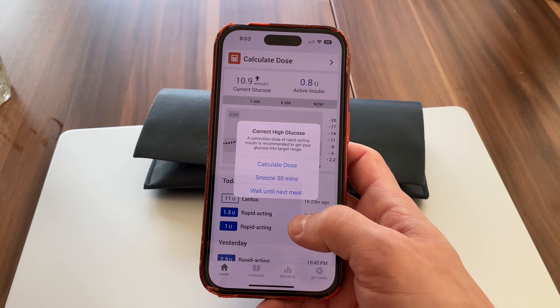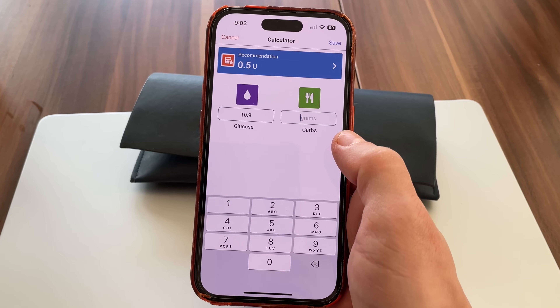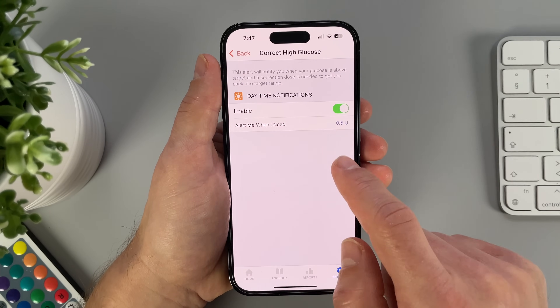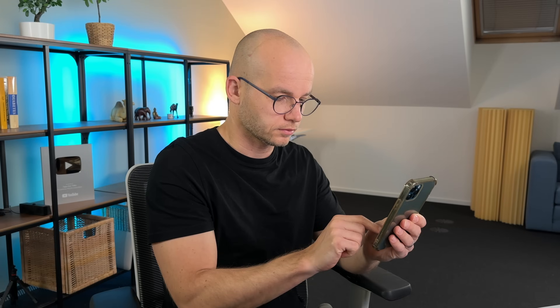That brings me to feature number 6: the InPen correct high glucose alert doesn't just tell me that I'm high — it actually recommends how much insulin I need to get back in range. Even better, I can customize this alert. I can tell the system not to alert me unless I need a specific insulin dose, as low as 0.5 units for tighter control or a higher value depending on how much I want to interact with the system. In real life, this really helped me with alarm fatigue and took away some of the mental burden of diabetes.